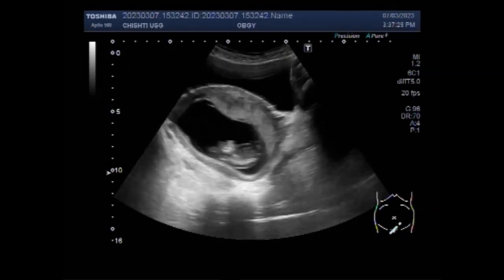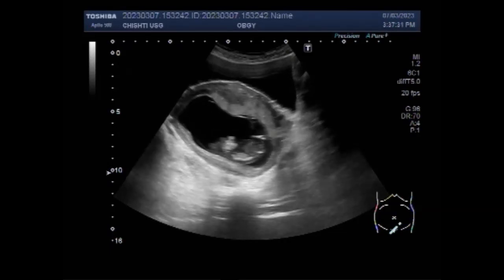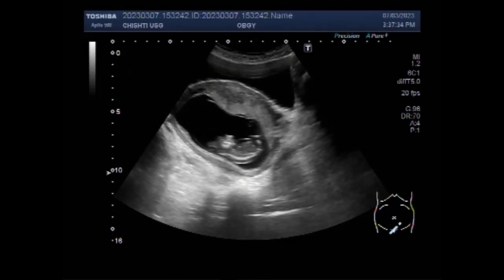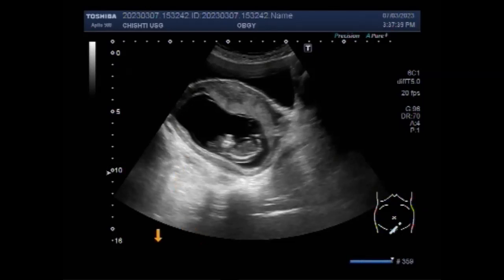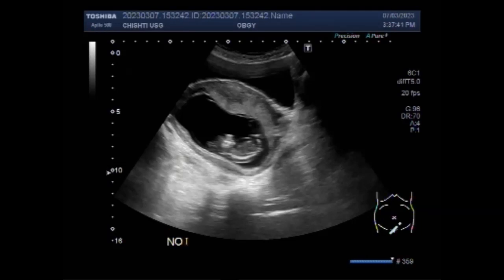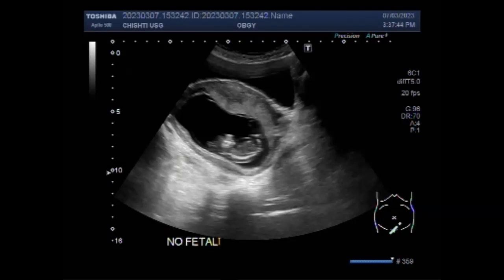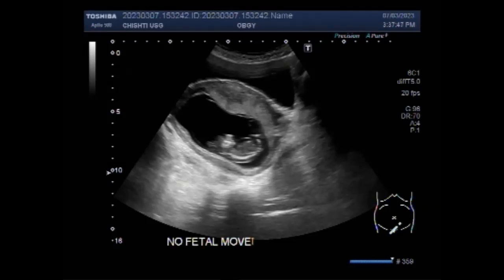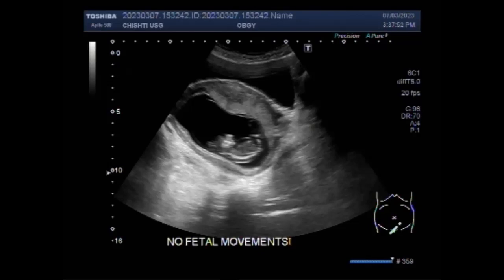Ultrasound diagnosis of miscarriage should only be considered when either a mean gestational sac diameter is equal to or more than 25 mm with no obvious yolk sac, or a fetal pole with a crown-rump length of equal to or more than 7 mm, without evidence of fetal cardiac activity. Transvaginal ultrasound is the mainstay in the diagnosis of miscarriage.